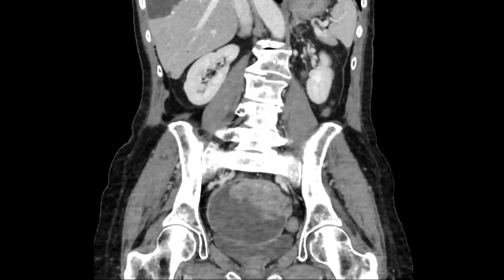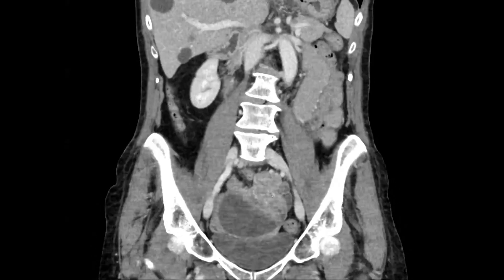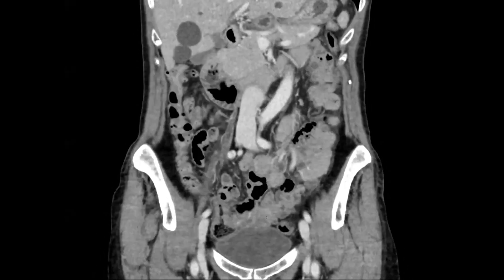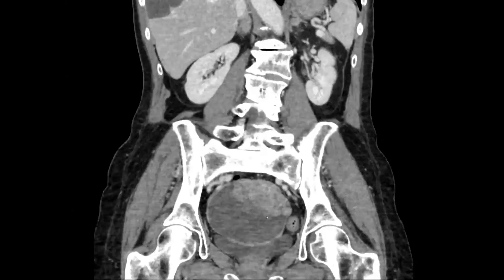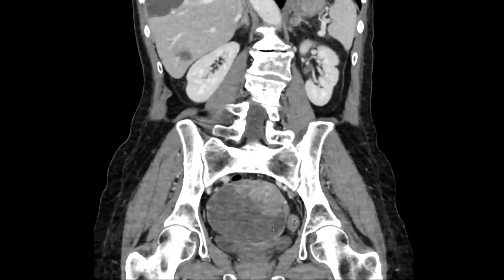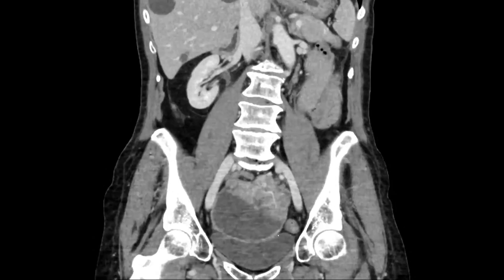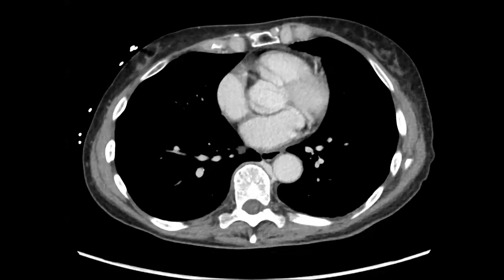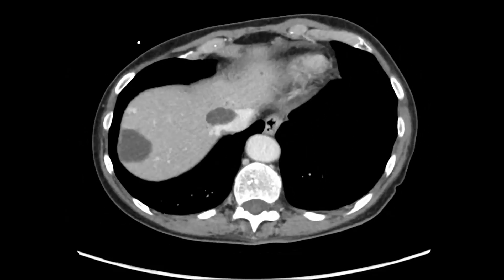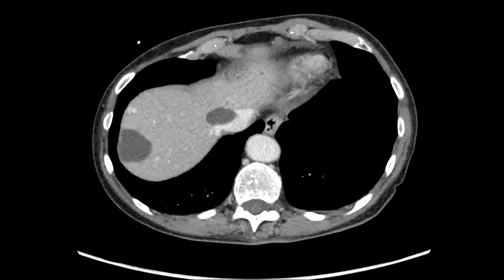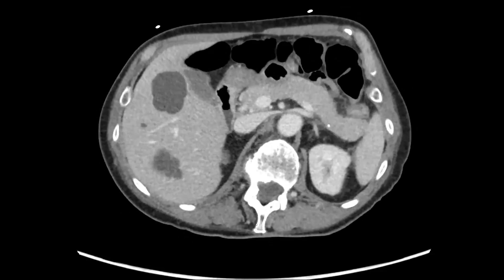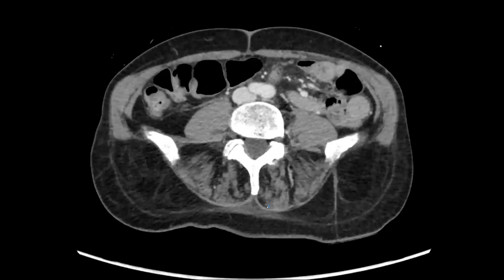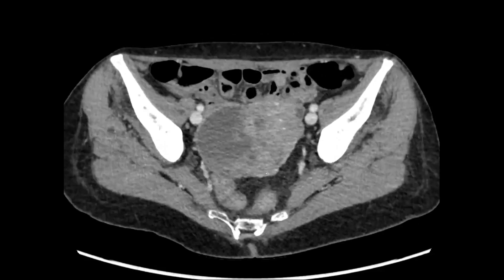This was a nice little GIST. Prospectively, recognizing vessels going from the small bowel into this mass, they might have considered giving Gleevec since it was pretty big — it could have been shrunk down. Ninety percent of GISTs are responsive to Gleevec. Also, for a big complex-looking mass you might call ovarian, if there's no ascites, no regional nodes, no omental thickening, no peritoneal nodularity — that should make you think of GIST.